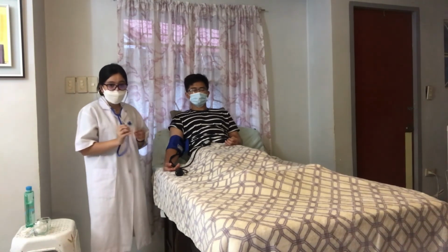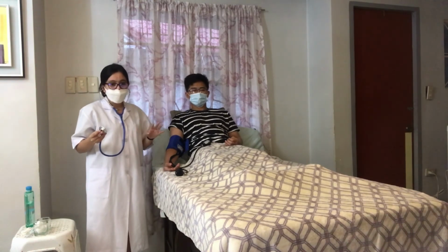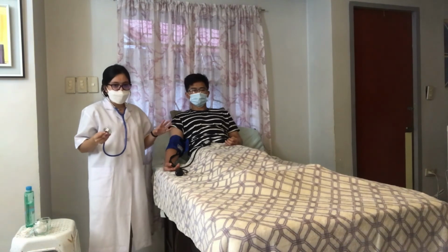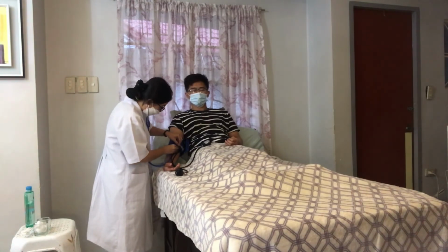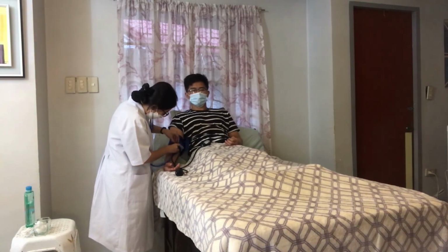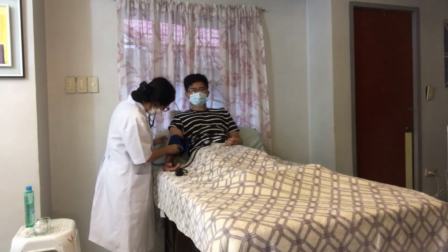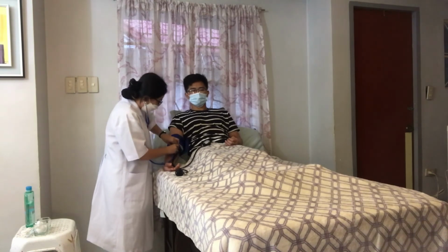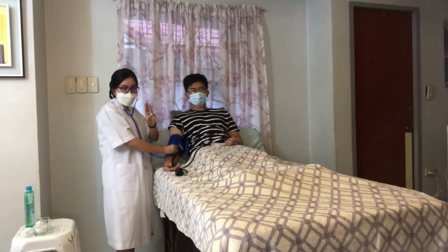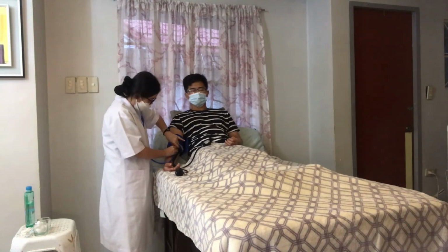Then we have to locate the brachial artery and place the diaphragm of the stethoscope over the brachial pulse. We must secure the chest piece by placing the palm of the non-dominant hand over it. So now, by using our fingers, we prevent the stethoscope from falling.